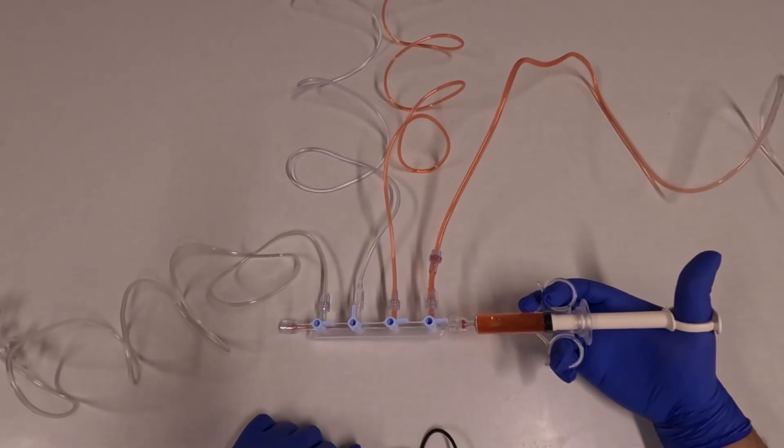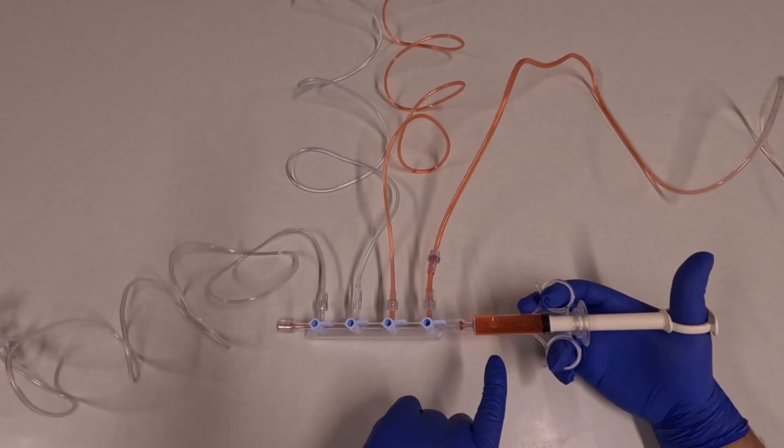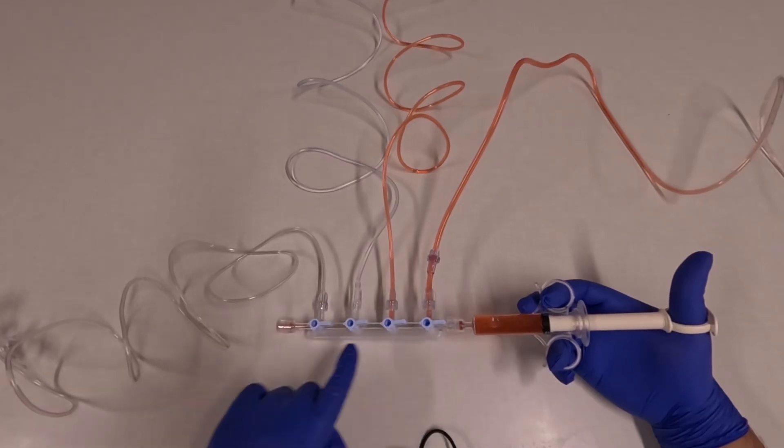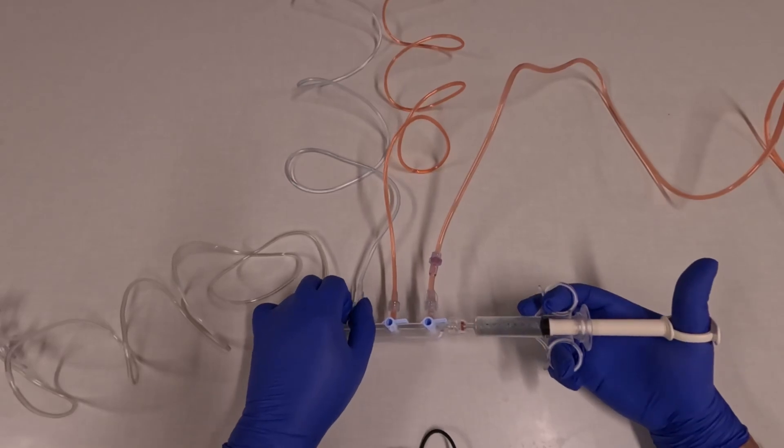Now if I want to dilute the contrast, I can turn the fluid port up and withdraw fluid into my syringe as well. So here, I have a 50-50 mix of fluid and contrast. Now I can inject that into the patient if I need.